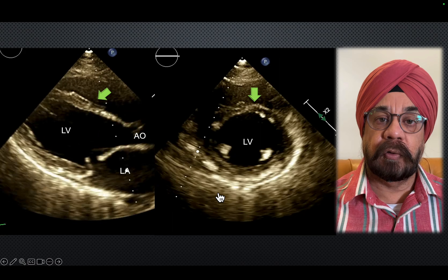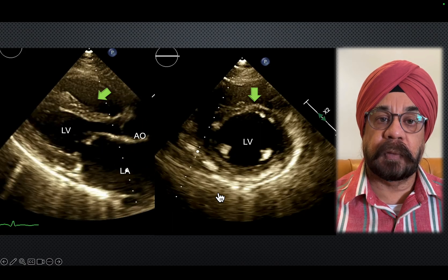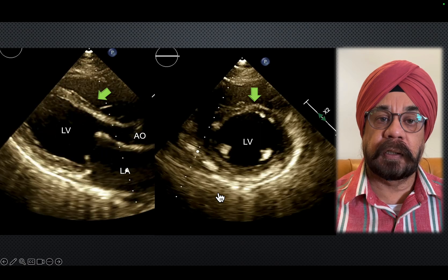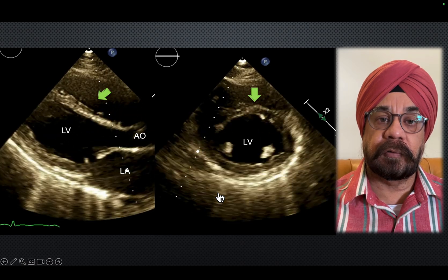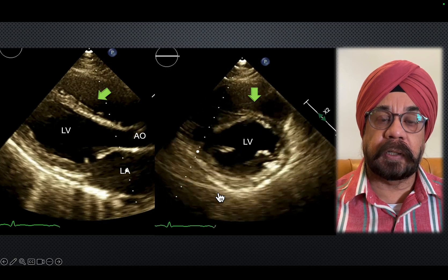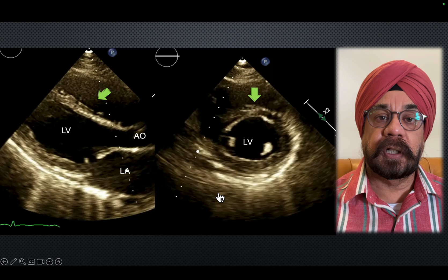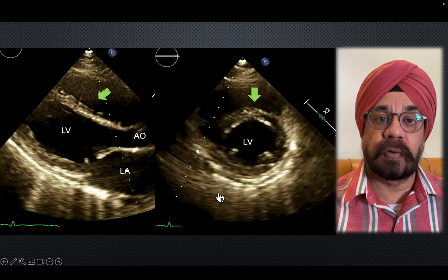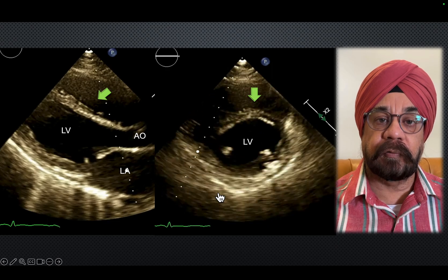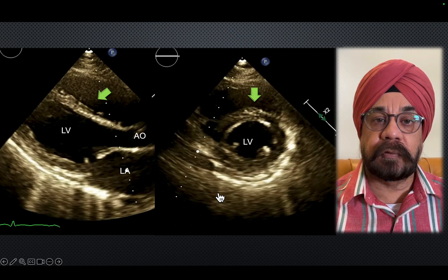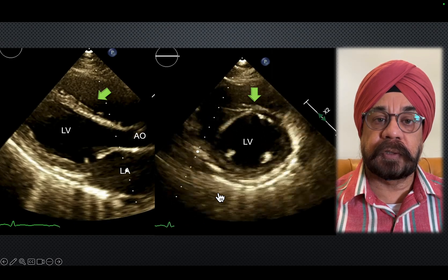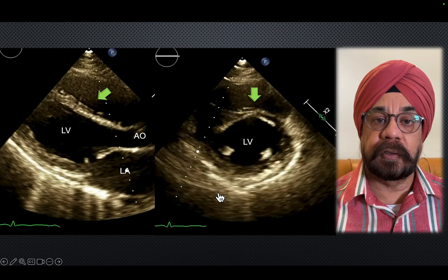The next step seen in this patient was a shudder of the interventricular septum — something you would also get in left bundle branch block. You see the shudder on a parasternal long axis view and on a short axis view. This is quite sensitive and specific for constrictive pericarditis. Please don't miss this; structurally the LV may appear normal on parasternal long axis and short axis. In this patient, followed up for six to seven years by multiple cardiologists, this finding was missed and CCP was missed.